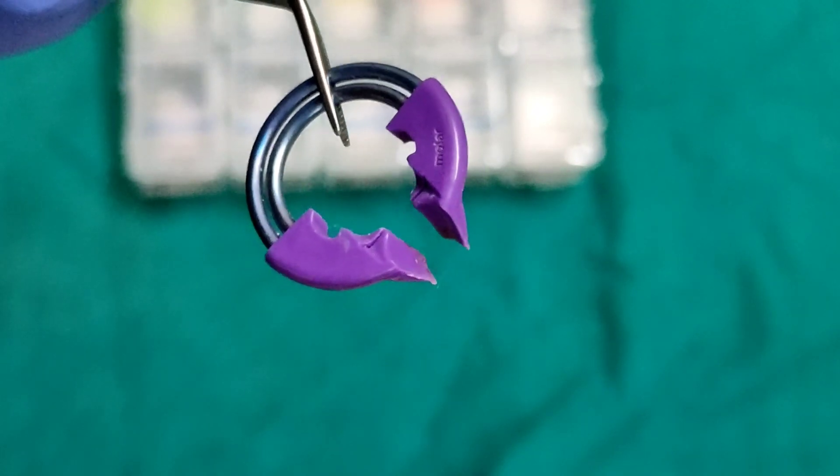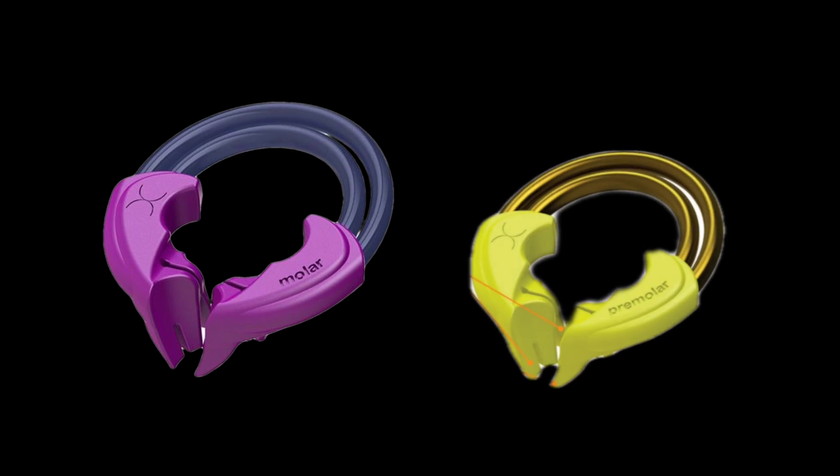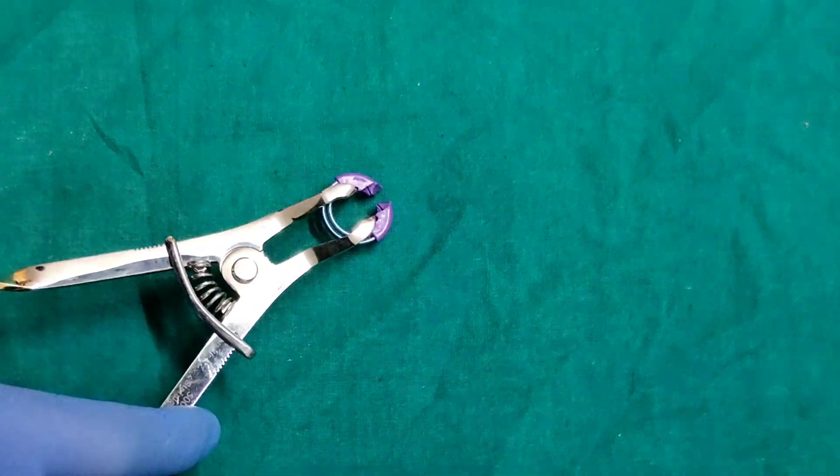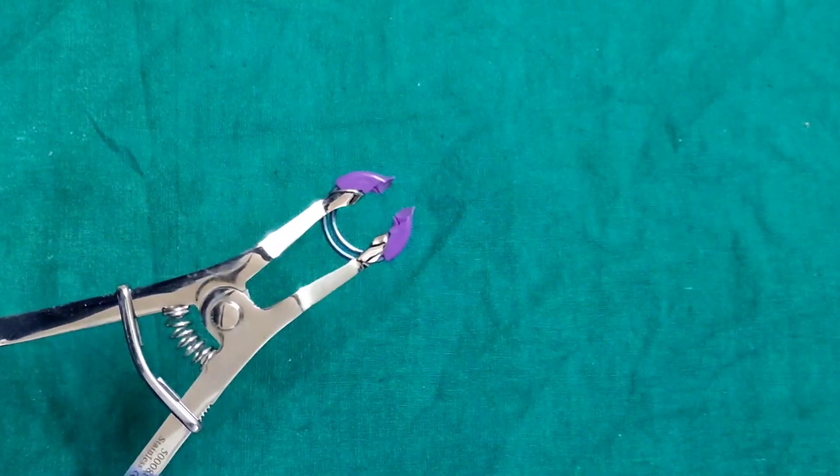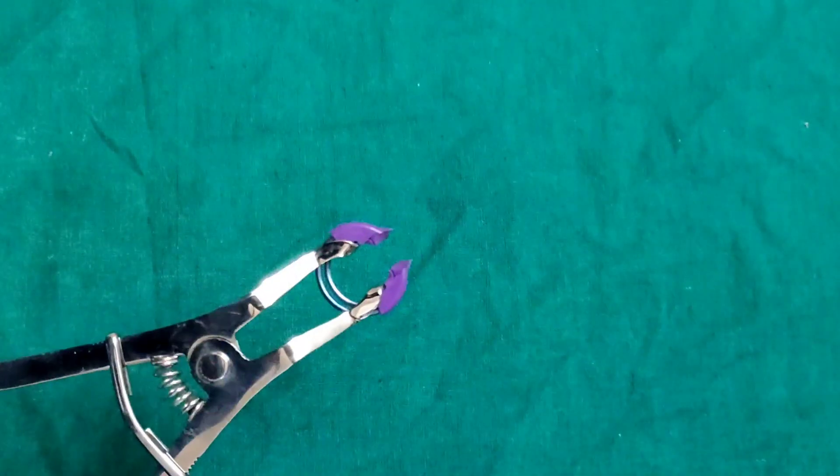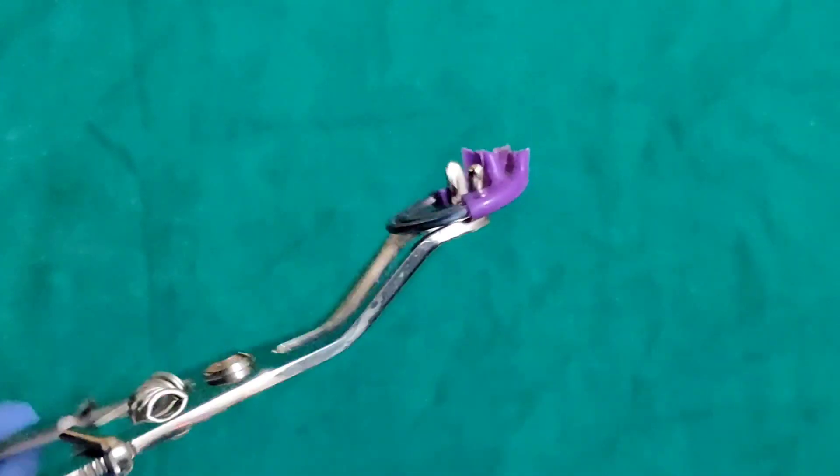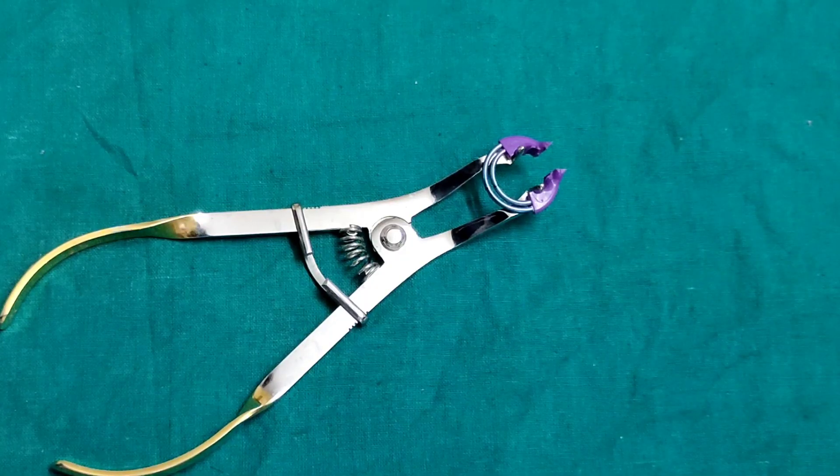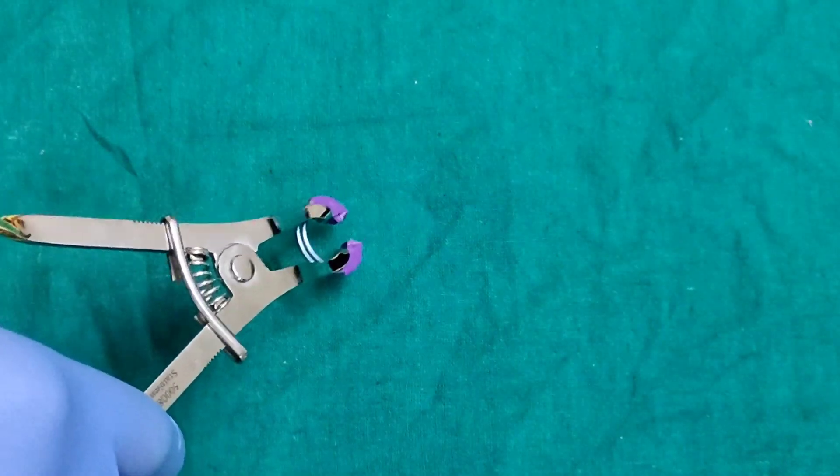There are two types of twin ring: purple for molars and yellow for premolars. The twin ring, BioClear's newest technological advancement, is designed to be used in sectional class 2 matrix adaptation. This twin ring applies a strong even tension that assists in separation of teeth, creates a strong seal with the matrix, and doesn't allow the composite to flow past the gingival margin. It also offers a significant reduction in hand strength during placement compared to traditional separators.